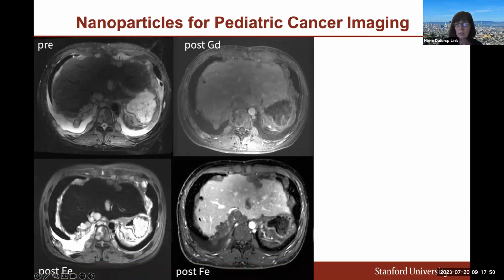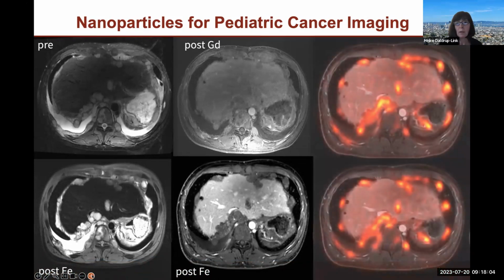And here on the T1 weighted scan, I can much better see the relation of the tumor nodules to the vessels here. And again, that can be important information if a surgical intervention is warranted. And here you see the superimposed PET information. Again, since these were truly simultaneous scans, we get a perfect co-localization of the PET signal with the MRI signal.